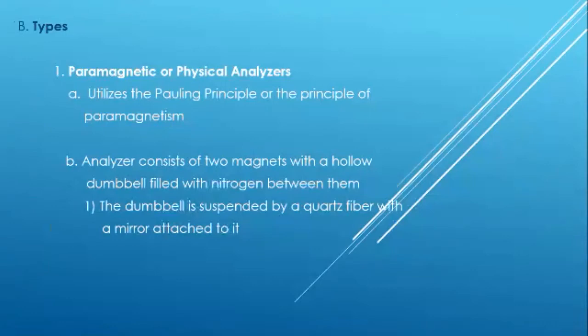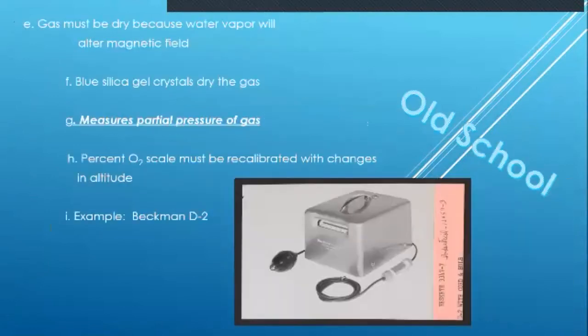Paramagnetic, or physical, analyzer. The paramagnetic analyzers measure what? Partial pressure of gas, and the gas must be dry.